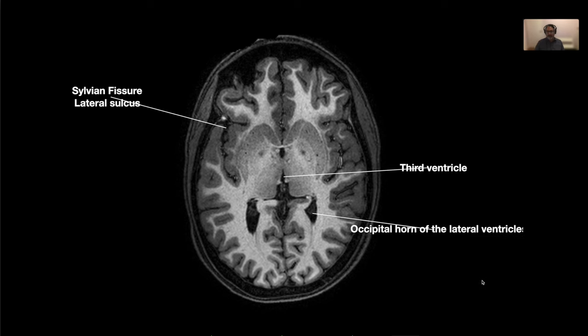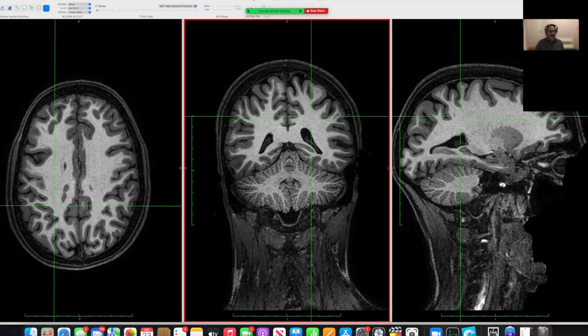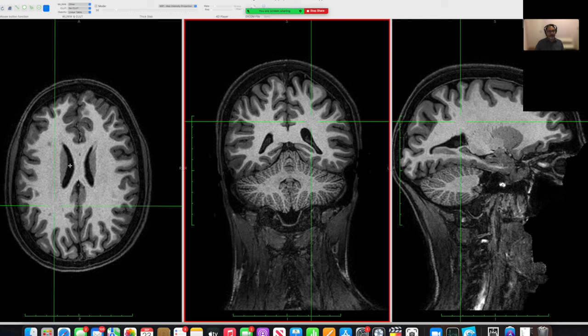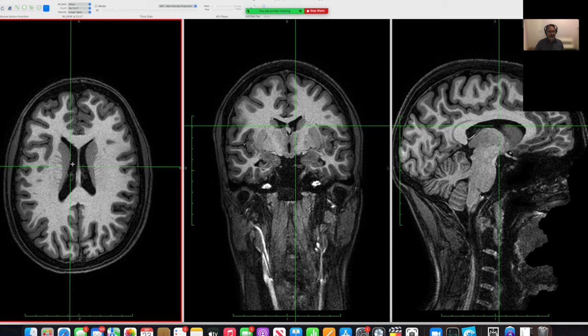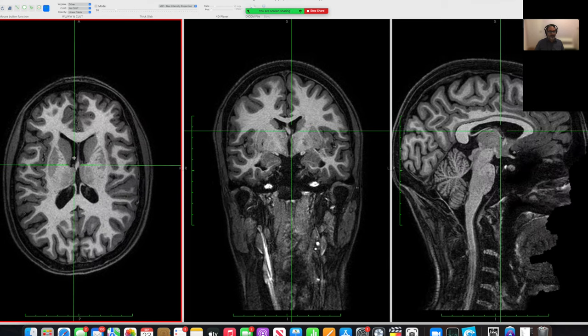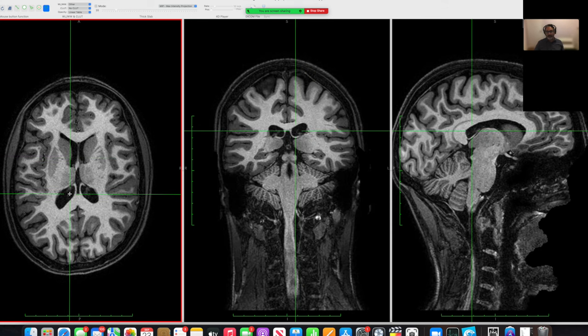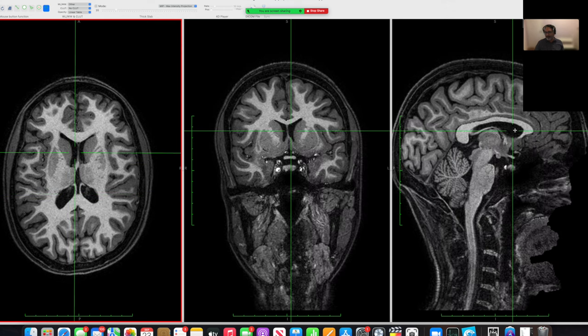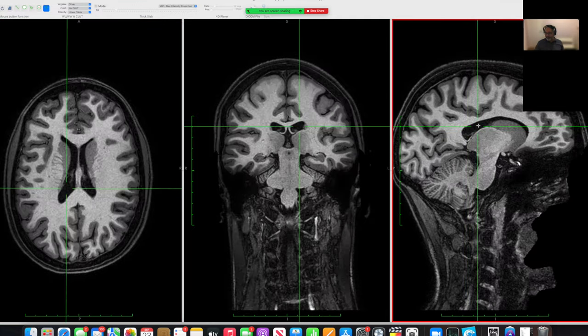Okay, and let's look at it again. So if you look at it here, so let's go superior. So we saw it here, right? So let's keep watching, and let me click on that so you know where they are here and you can see where they are there, right? So let's keep going inferiorly. So now you can see they're sort of connecting. Let's keep going inferiorly. So that's the anterior horn and that's the occipital horn. So I'll click on the anterior horn again. You can see it there and there. And I'll click on the occipital horn and you can see it there and there. So you see, that's the lateral ventricle there.